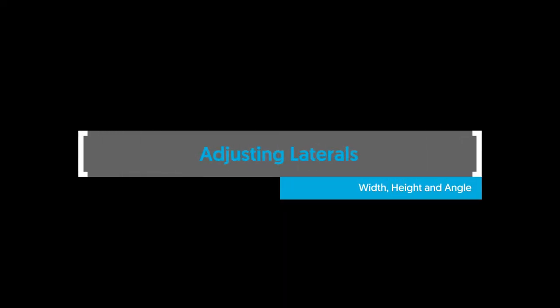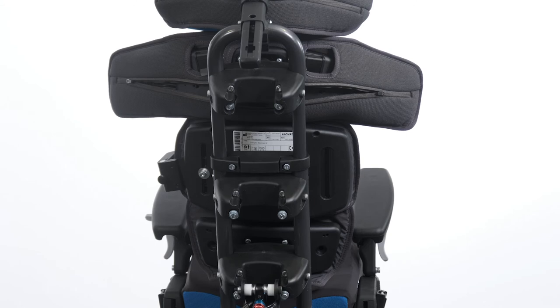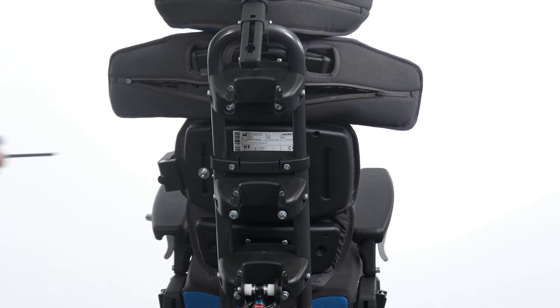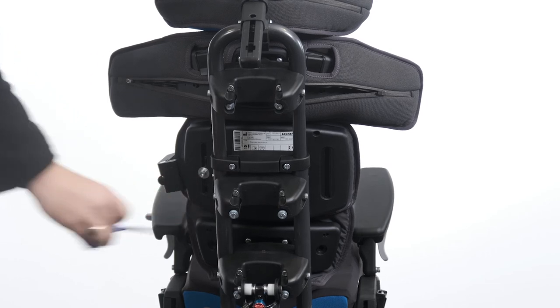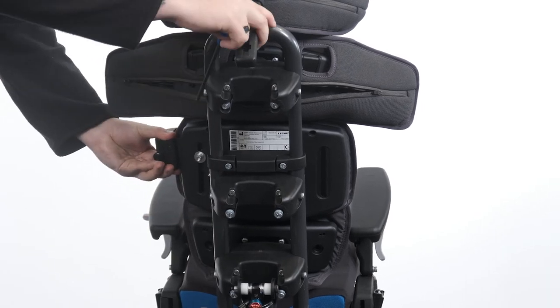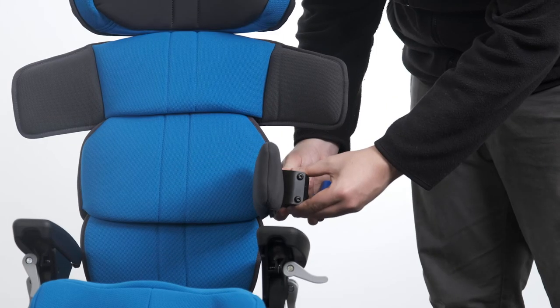Adjusting laterals — width, height and angle. To adjust the lateral height, width and angle, loosen the bolt at the back of the backrest. Adjust the height, width and angle to the desired position and tighten to secure in place.